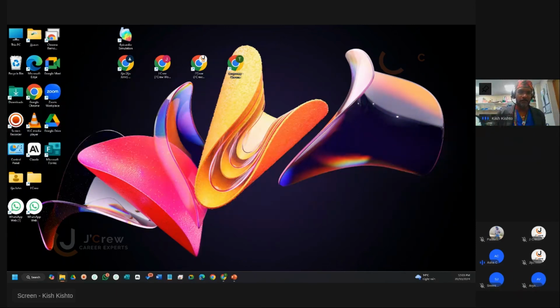To find a pannus in the chamber, they say pannus is a growth, it is there. They say if there is a clot, that region will be akinetic, and there will not be color flow. They'll put color flow and see whether the flow is there or not in the particular region where there is a clot. So they find the clot, and I don't know how to find a pannus.